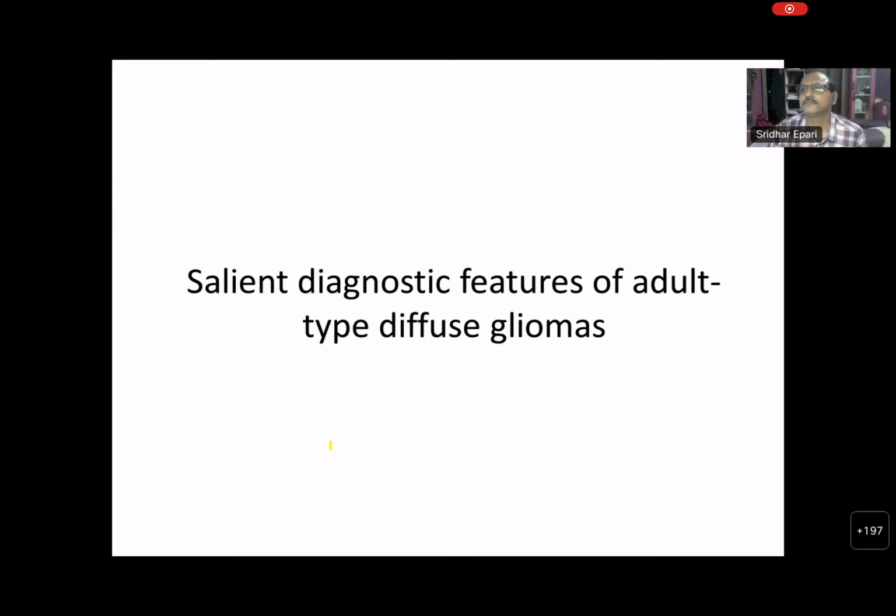Is there any cutoff percentage of cells that need to stain to call it P53 mutated? So we don't report anything. My suggestion would be don't ever report anything in the IHC as P53 mutant. There are two ways of reporting it. You can express what percentage of tumor cells are showing intense, strong positivity. You have to say that.